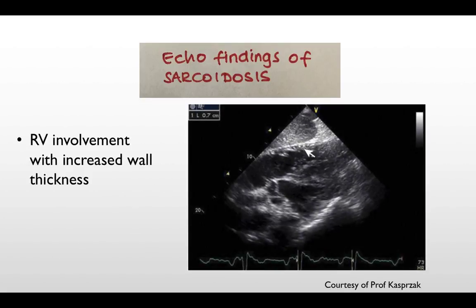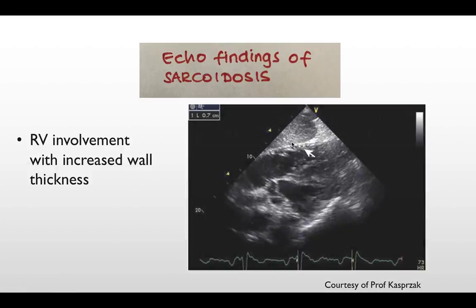Another important feature we expect to see in patients with sarcoid heart is involvement of the right ventricle. This subcostal four-chamber view shows clearly there is increased thickness of the right ventricular free wall. The normal thickness in this view is up to 5 mm, and this measurement is about 7 mm, which is obviously thicker than normal.